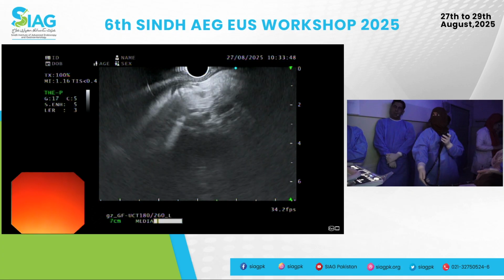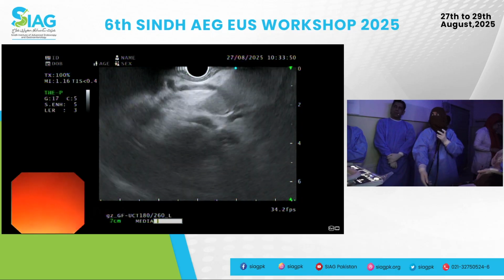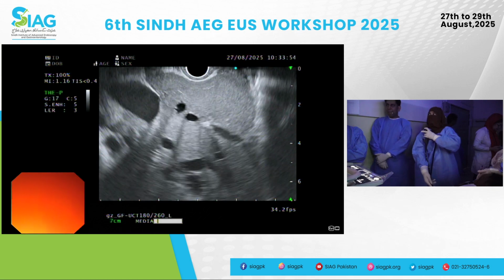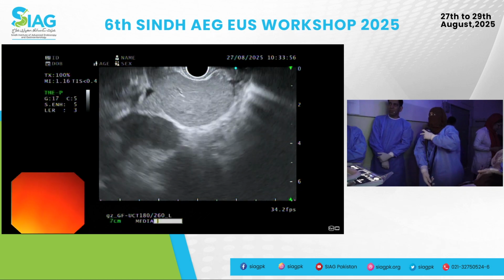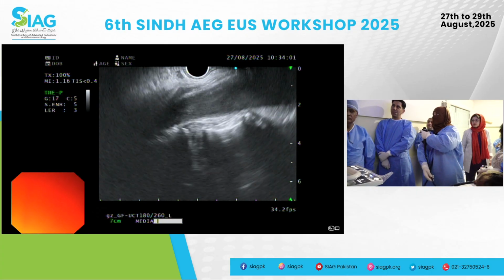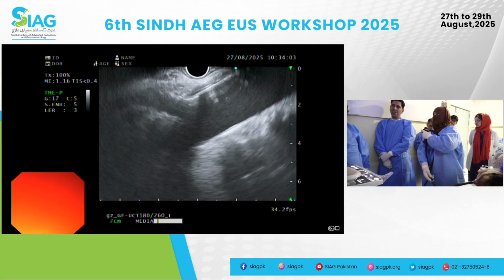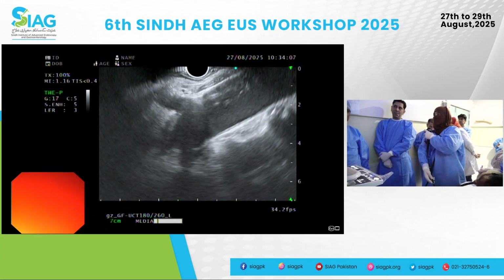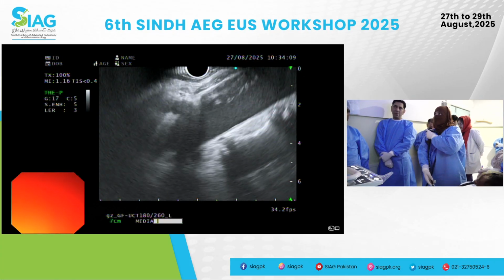So the left lobe. Suction, tip up. Good. Reduce this a little. Keep going to the right. Good, very nice, good, well done, excellent. So celiac axis, diaphragmatic crus. Good, okay. What are you going to do next?